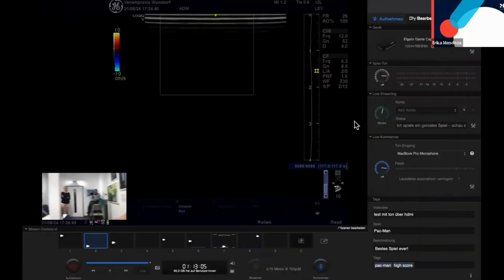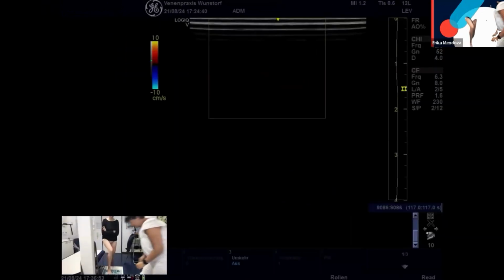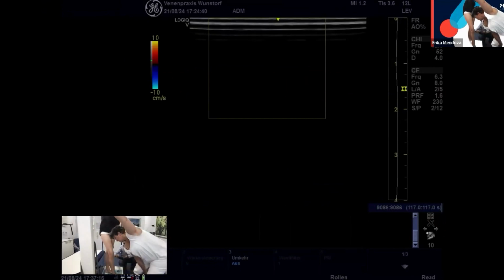Everything is fine. So I go back to my ultrasound from the MOH, where the spiders are actually not there. Now, to show a lady with visible spiders, also in this corner, she has visible spiders. If you look here, she has the beginning of a brownish discoloration. It is not so light.